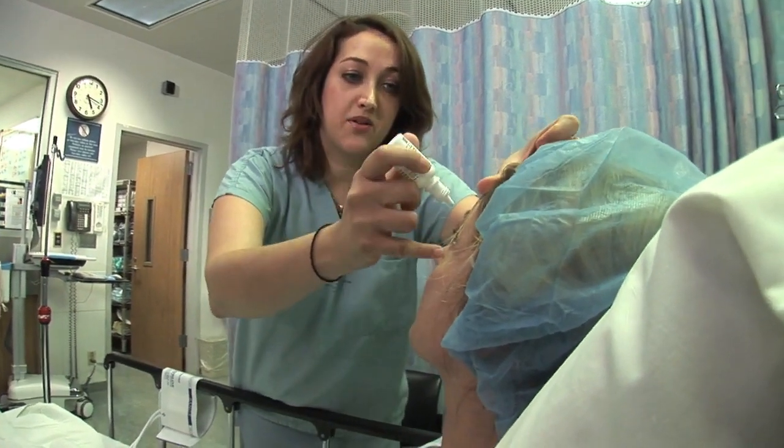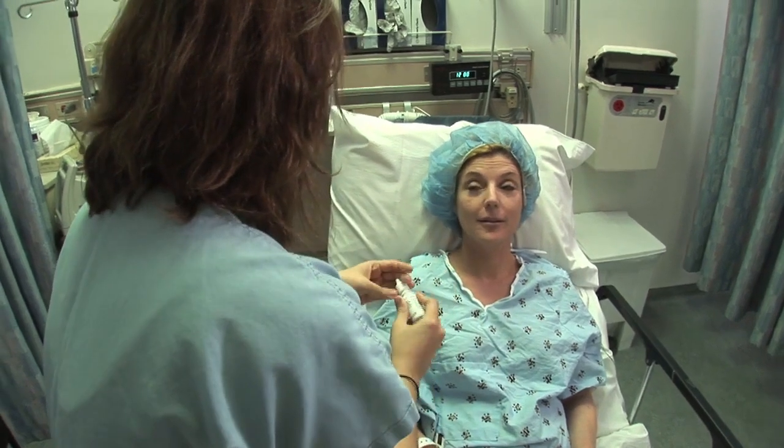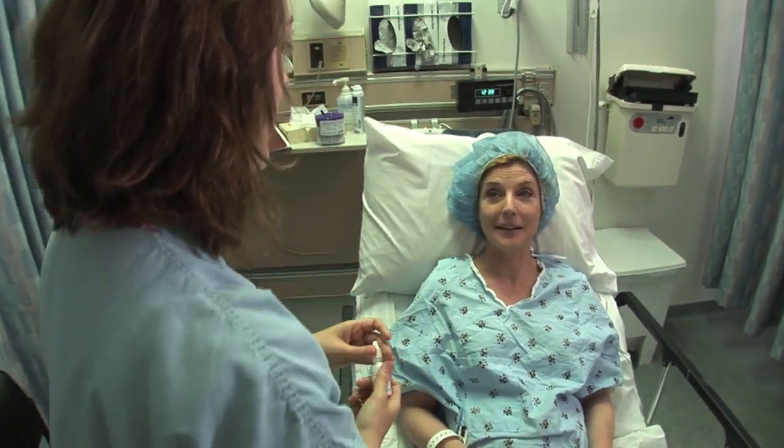Your eye will be prepared for surgery with a series of eye drops to numb the eye and guard against infection. When the surgeon arrives, they will confirm all is in readiness and that you are comfortable and ready for surgery.